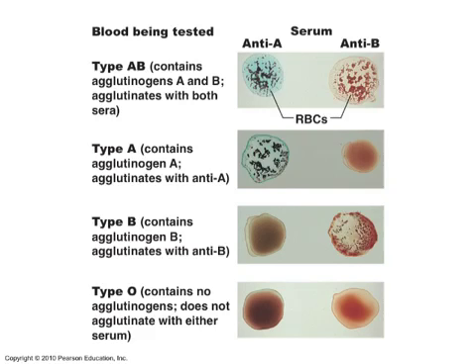Up here, we're looking at two different serum types. This is convention for talking about the antibodies. You have anti-A, so they recognize type A agglutinogens. Anti-B serum contains antibodies that recognize type B agglutinogens. So, if you have blood that's type AB, it has both A agglutinogens and B agglutinogens.